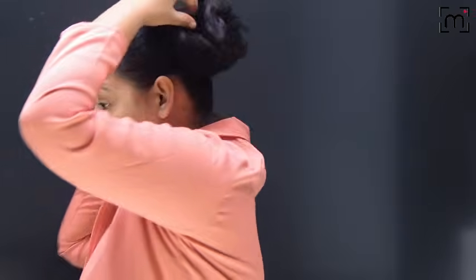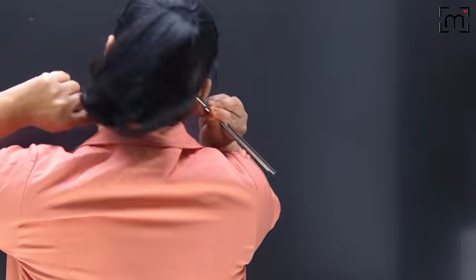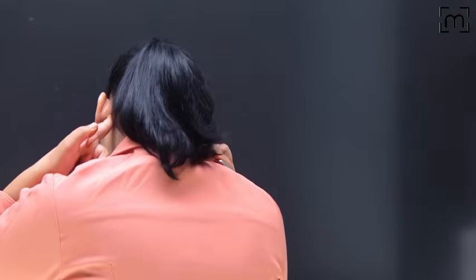In AC, it should go till the cochlea and after that it is obstructed. So you say BC should not be felt and AC is felt normally, but it doesn't happen. Whenever I keep it on the mastoid, since the vibrations can't go here, they will cross and activate the cochlea of this side.